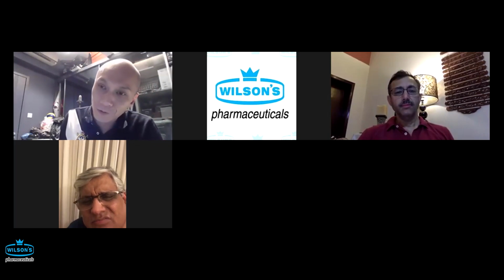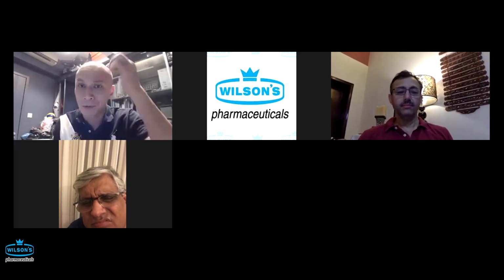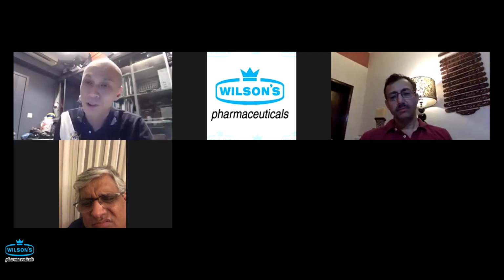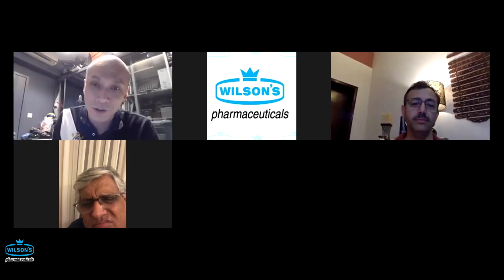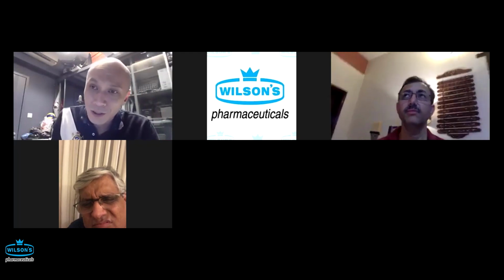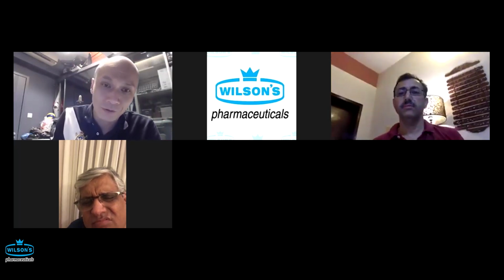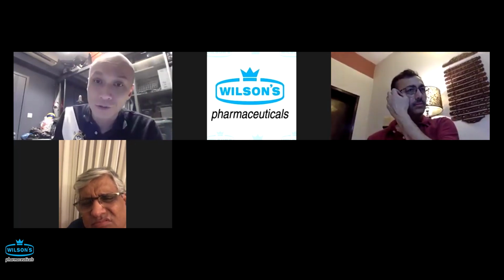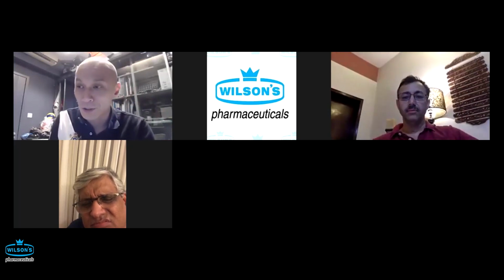I think for a patient with very dilated ducts, with the sphincteroplasty you can actually open up the papilla a bit more. So for very large stones, there might be some benefit. And I think just now Professor was talking about small stones, particularly in patients who are on anticoagulants where you don't want to perform a sphincterotomy. So this is one option you can do. It's not a very common indication, but if it does happen, then that's one of the options you can consider.